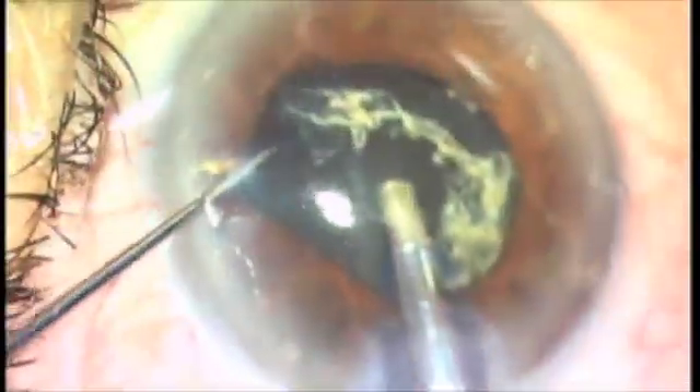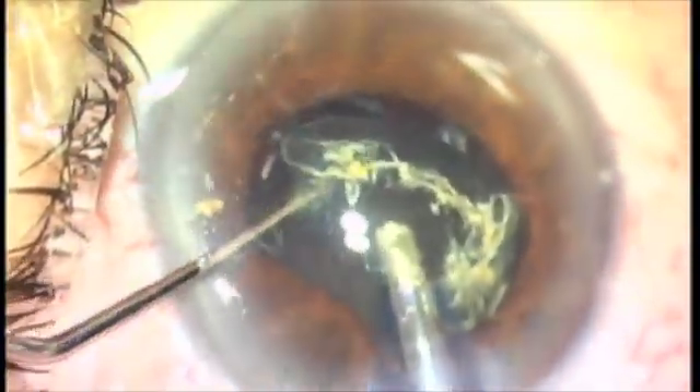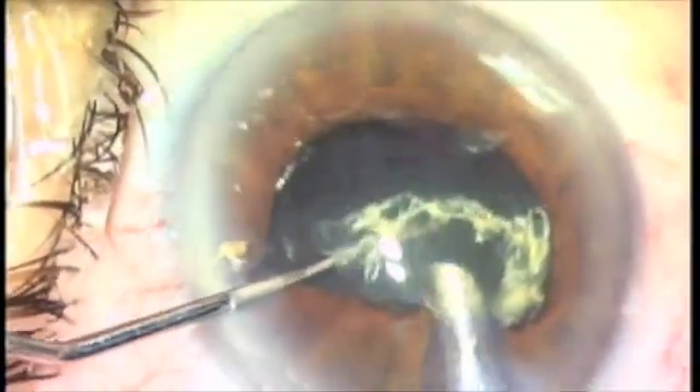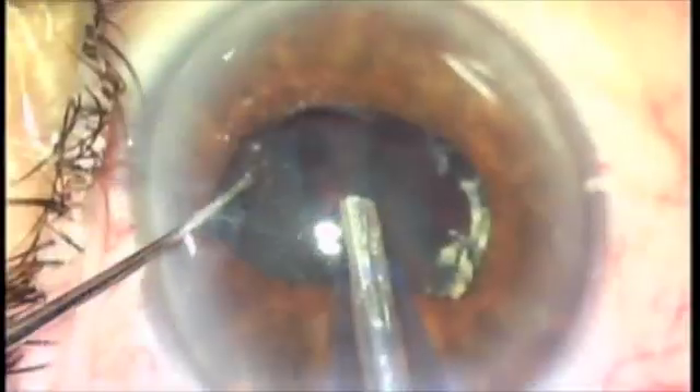Raising it up in the iris plane, but I'm very comfortable here. So I keep manipulating, I keep cracking — here's another crack — and those particles are slowly nibbled away in the center of the pupil.